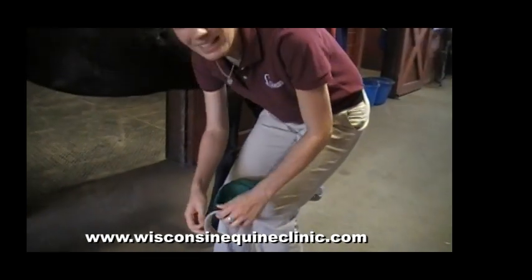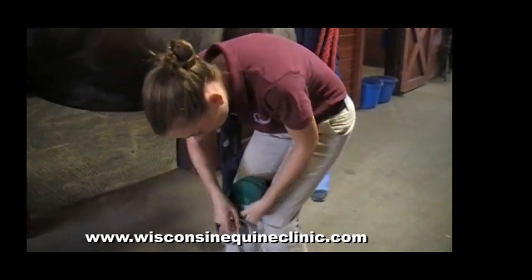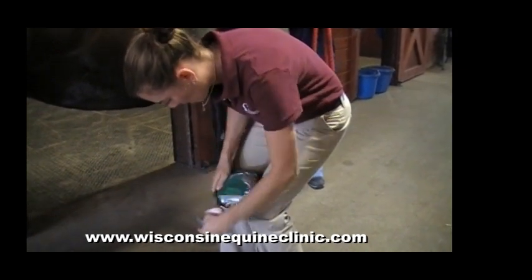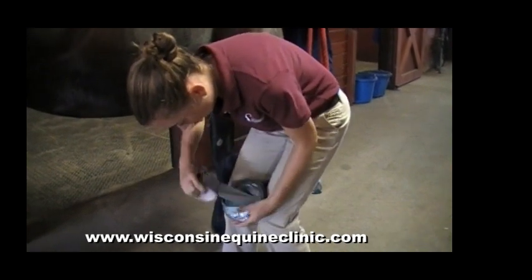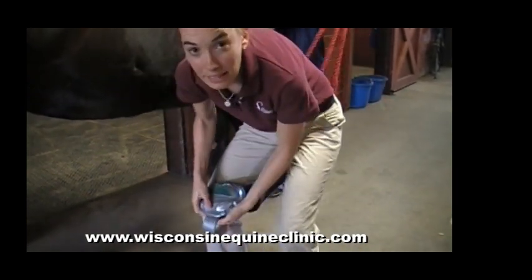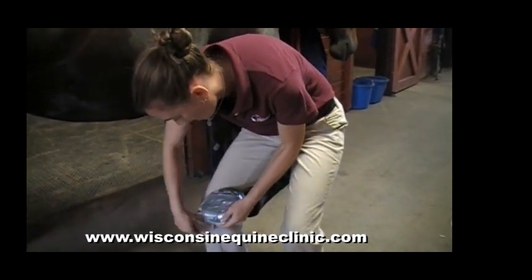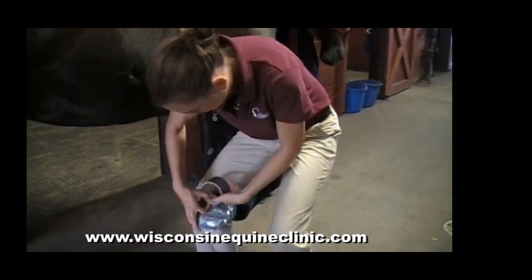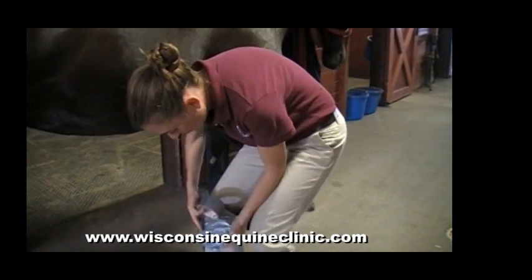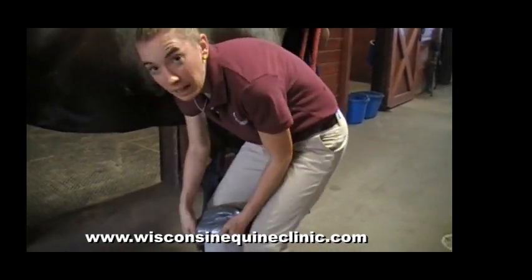Then we use our duct tape — and duct tape, as we all know, cures all things. Start with special attention especially around the toe, and begin circling the bottom of the hoof, pressing it down in place. It is important to make a good seal for the bottom of the hoof, as moisture can affect your medication, and we want to keep the bottom of the hoof clean and dry. Make special care that you're not going too high up on the skin of the horse, so that we're not cutting off circulation to the coronary band.